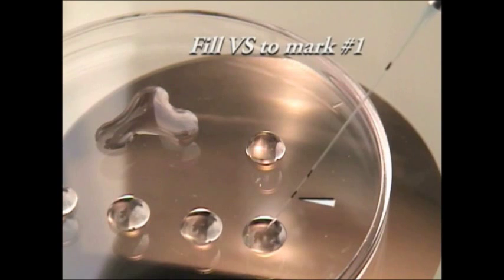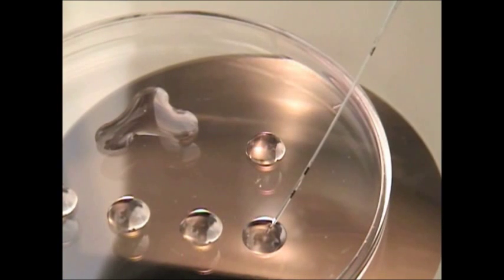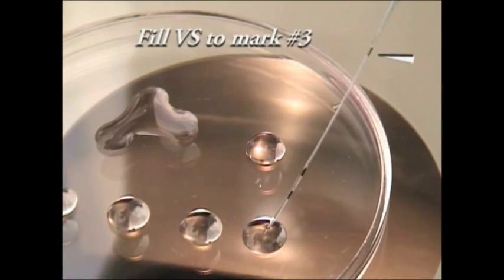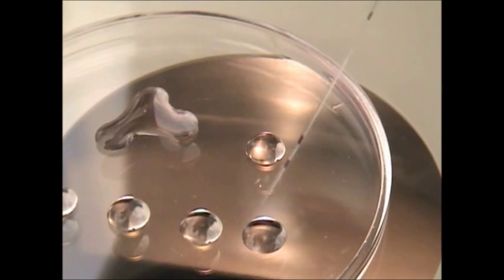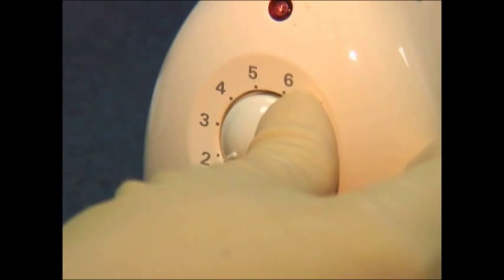Next, using the cryo tip, the vitrification solution is drawn up to mark one on the cryo tip. This is followed by loading of the embryos or the oocytes into the cryo tip. Next, the cryo tip is filled to mark three with the vitrification solution from drop four.